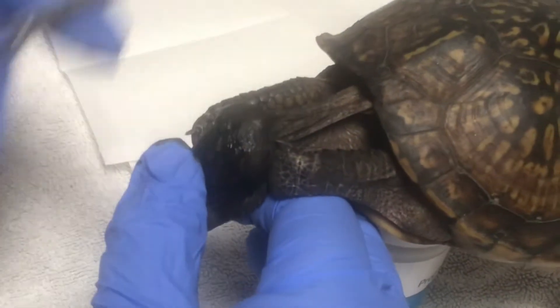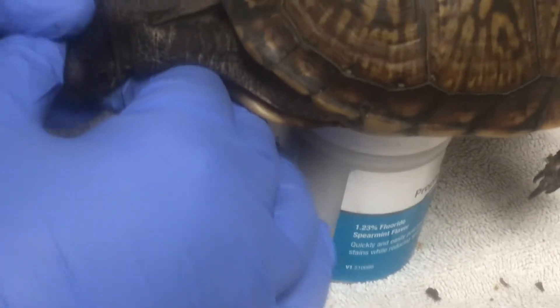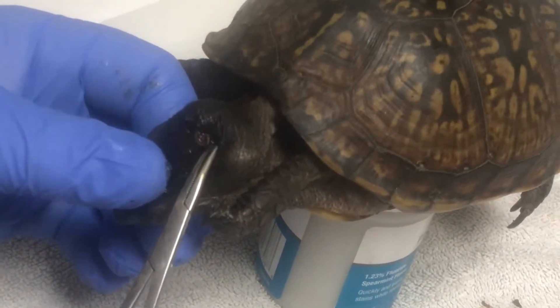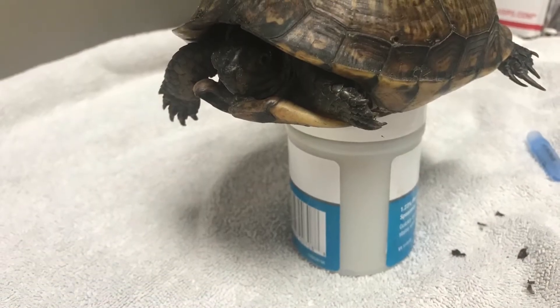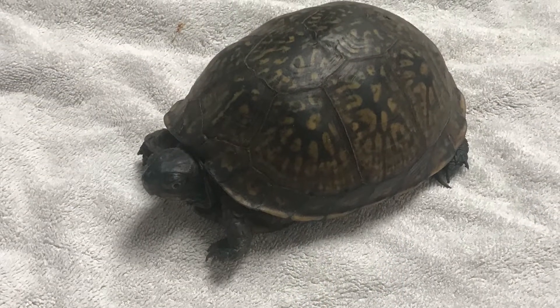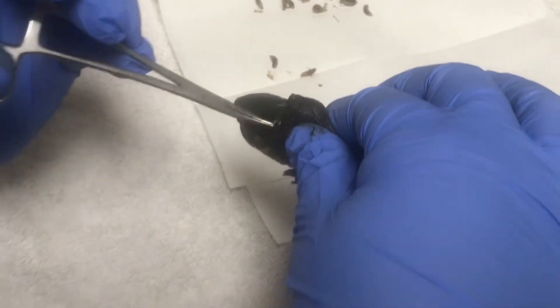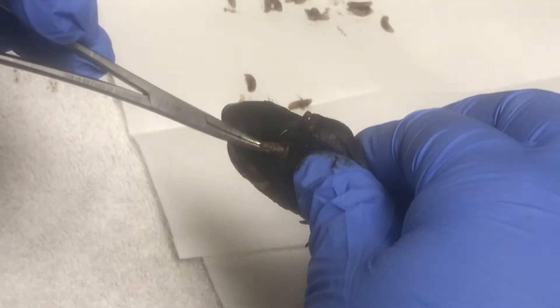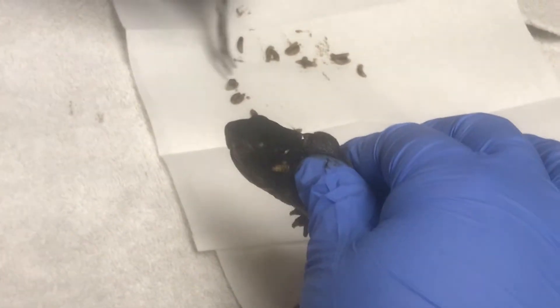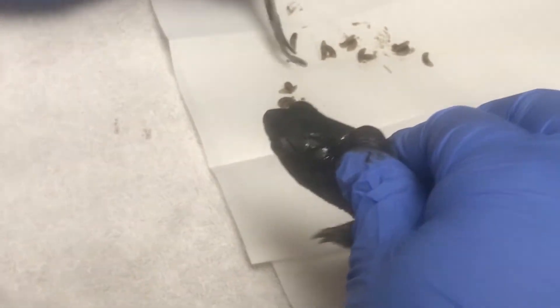You can't have your head back yet — I'm trying to remove the maggots from your body. Hey, get it together here. Stay on your cup. Get your head in the game. Sadly, these two maggots were not filmed coming out, but we figured out the problem with the phone. All right, here's some more maggots — two at one time. Yuck. And another two. Another one.